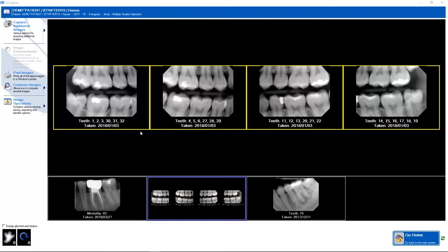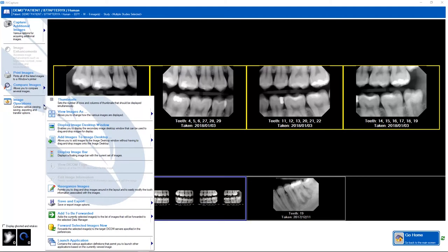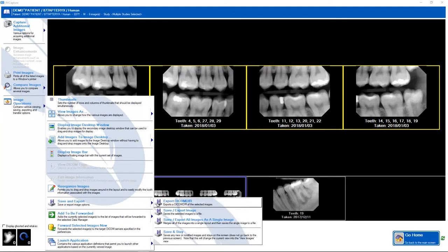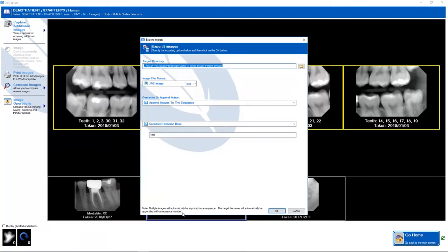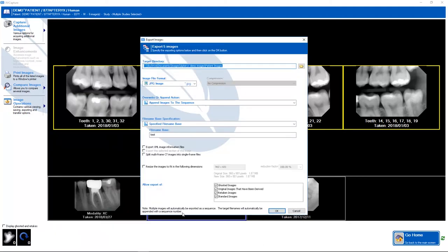Once I've selected the images I want, I go to Image Operations, Save and Export, Save Export Image.